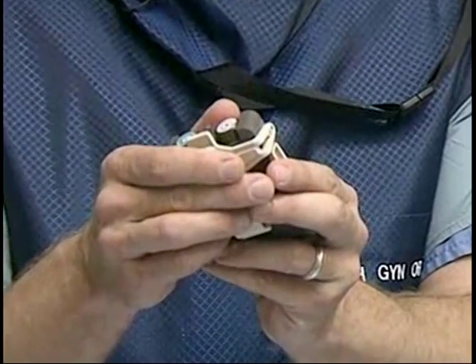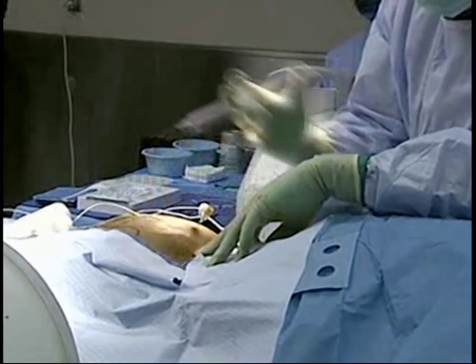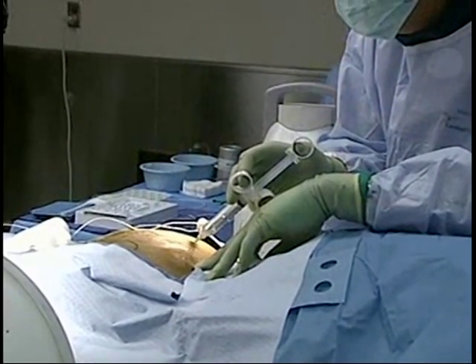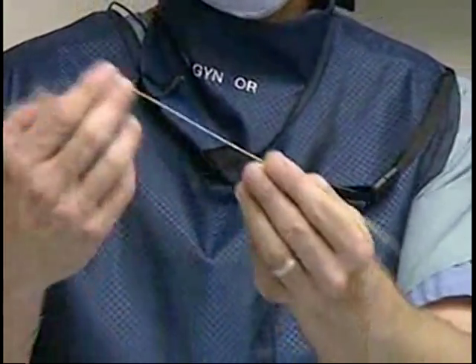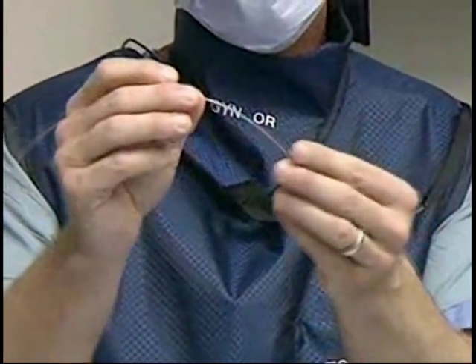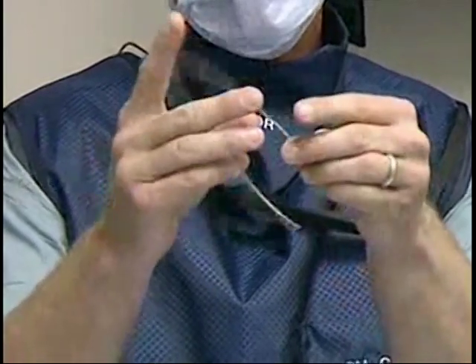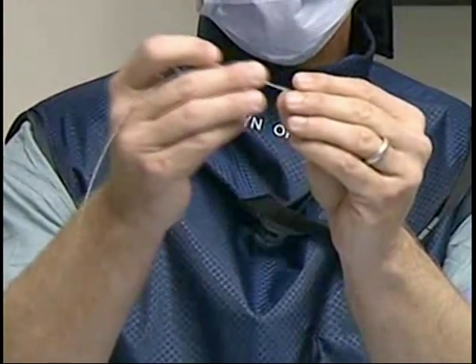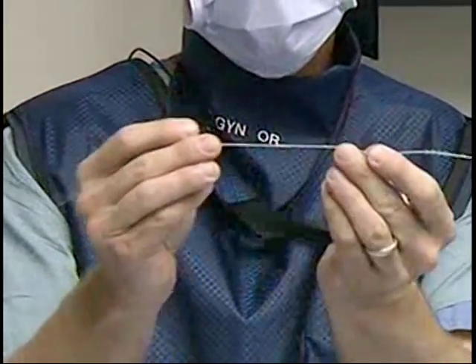If the test works well, we can start talking about the possibility of a permanent implant. The temporary lead is very fine and just comes out to the skin. The permanent lead is a little thicker but is implanted below the skin — you will not see it. It has small tines to prevent it from migrating, which allows you to be active so the actual therapy will continue to work.